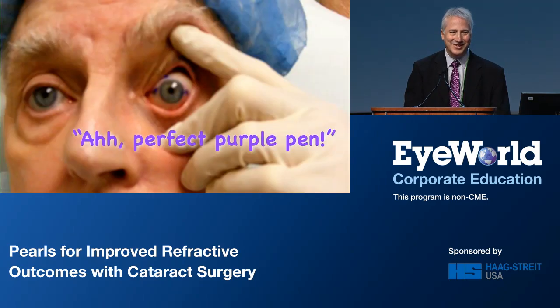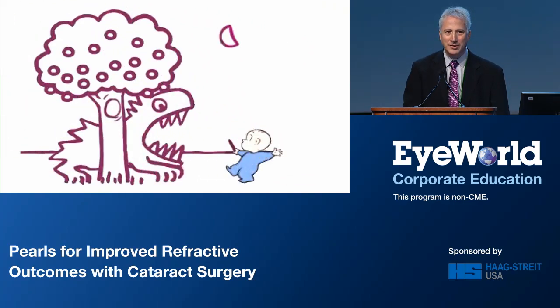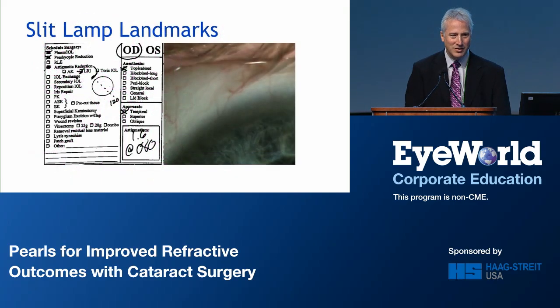And this just doesn't look that perfect to me. There are other people who have come up with solutions, but using the purple magic marker, it's not that sophisticated and it doesn't work that well. And sometimes I'm betting that it can bite you in the pajamas. So I would recommend against that. There's much better techniques, and the Lenstar is a better technique.